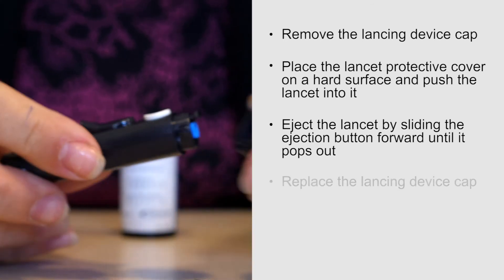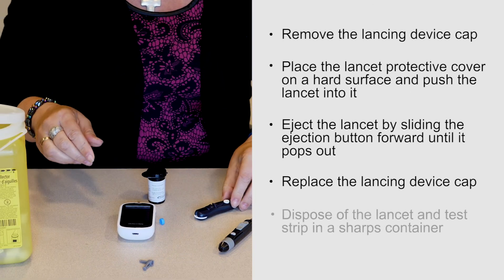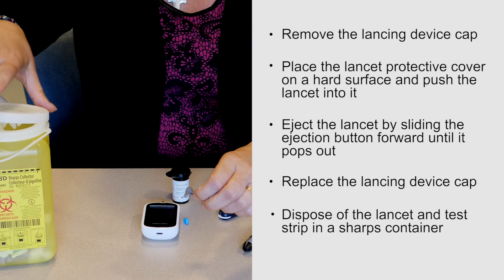Eject the lancet by sliding the ejection button forward until it pops out. Replace the lancing device cap. Dispose of the lancet and test strip in a sharps container.